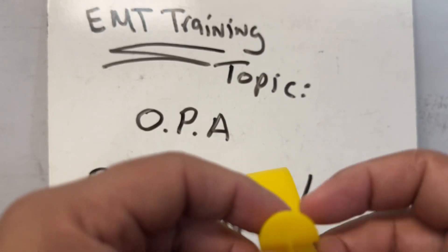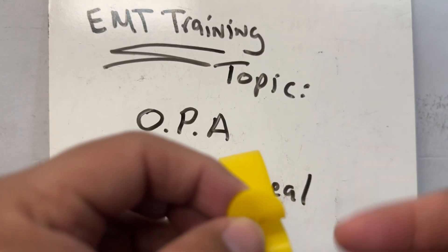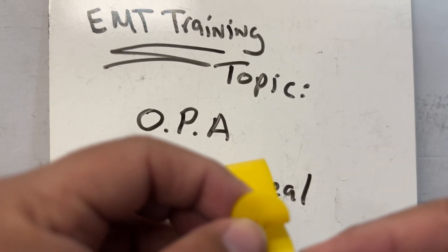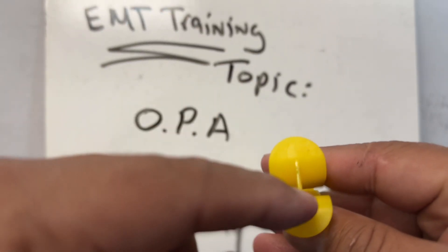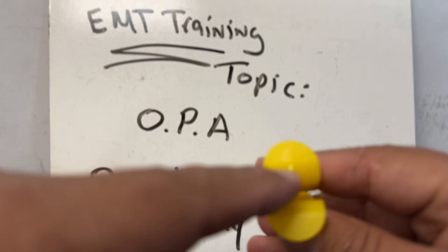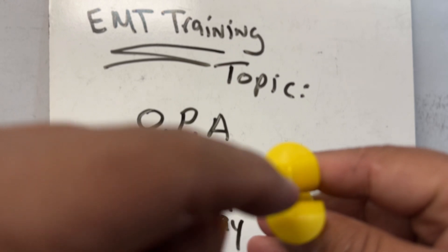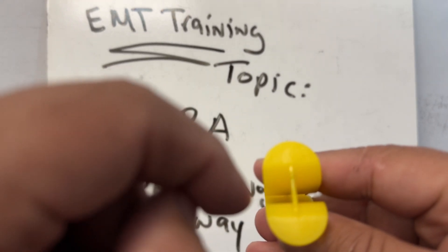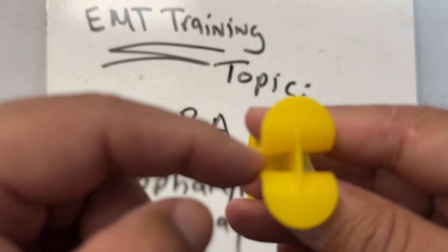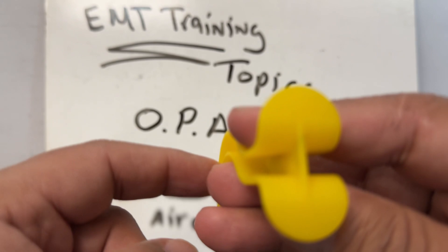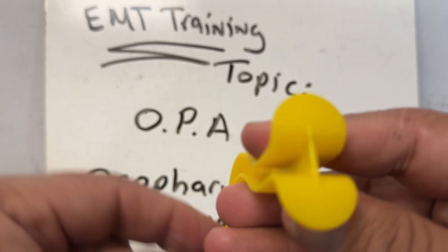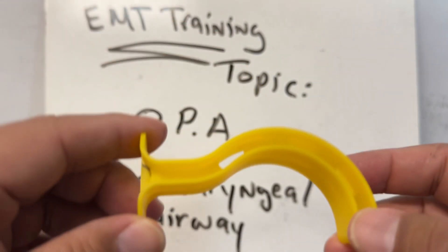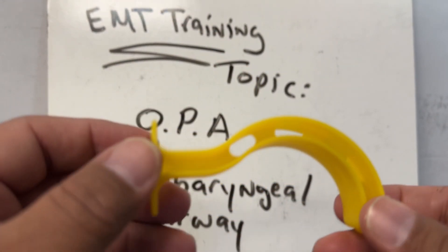There are little grooves here on the device that allow suctioning if needed. Suction is possible through the opening on the side. Some OPAs have a closed circular center where you give ventilation, while others have an opening on the sides for suctioning.